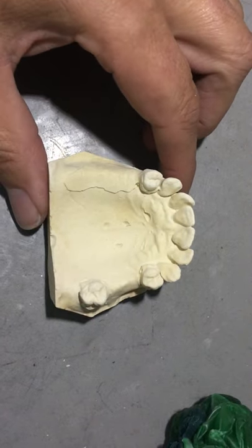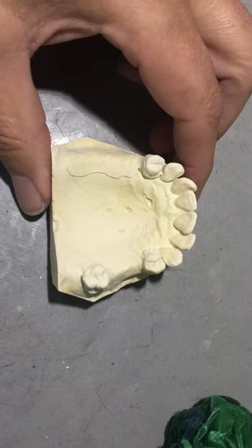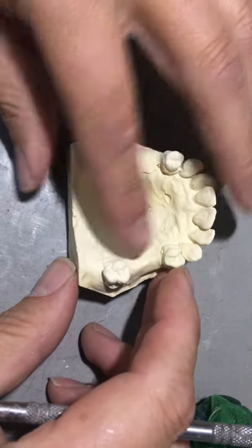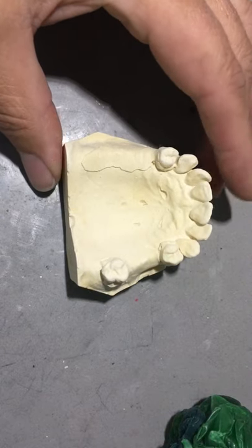So this is our project 3, Kennedy class 2 modification 1. This is our blocked out refractory model. Hopefully nothing lifted while you were duplicating with the silicone.